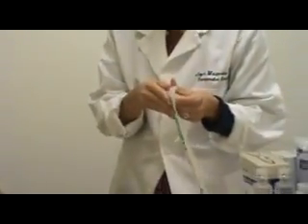Oh, I would actually throw that away, not put it near my sterile field. And if this is a one-time use measuring device, I would also dispose of that. Okay, next I'm going to remove my gloves, perform hand hygiene again, watching my sterile field, and I'm going to put on my sterile gloves.